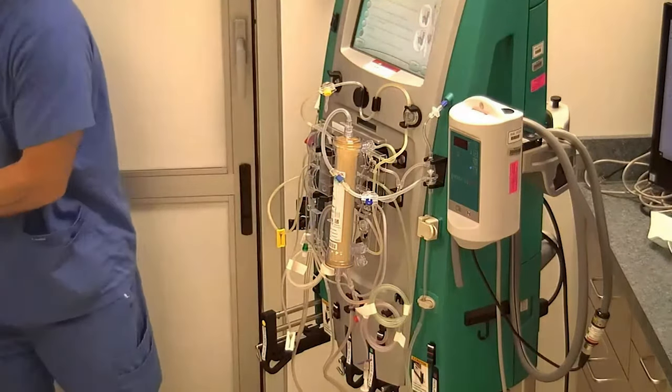So we've come to the point now where we've finished our first prime. And the screen says priming, 1 of 2 cycles complete. So all we need to do from here is just take your empty bag. We're going to hang our full one over here on the priming hook. Take this old empty bag off. Spike our second bag. And then from here, all you have to do is hit next cycle.